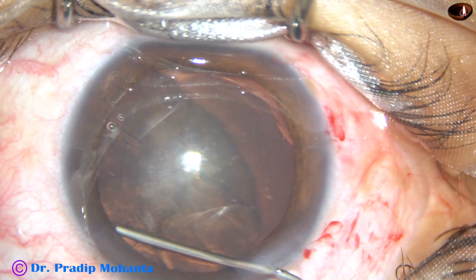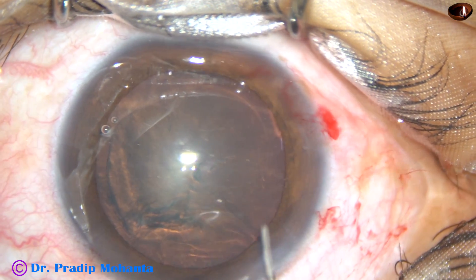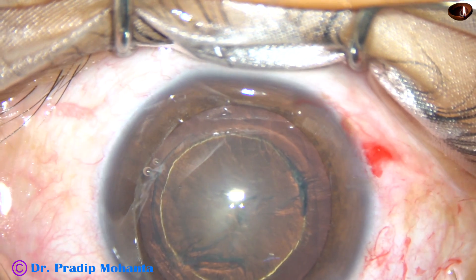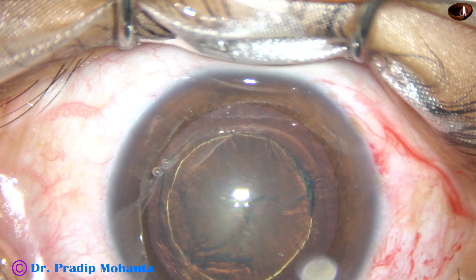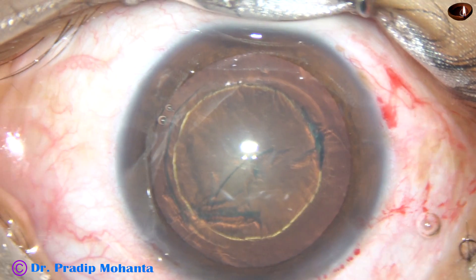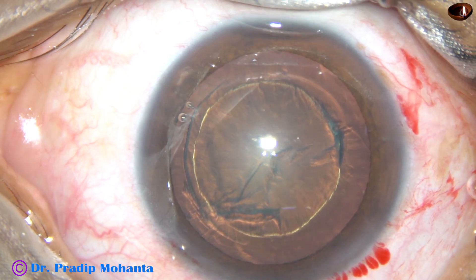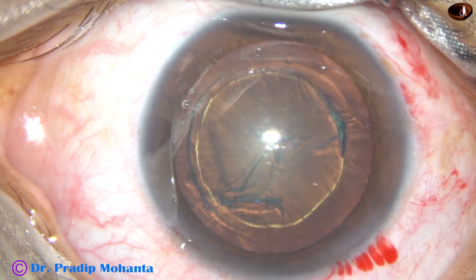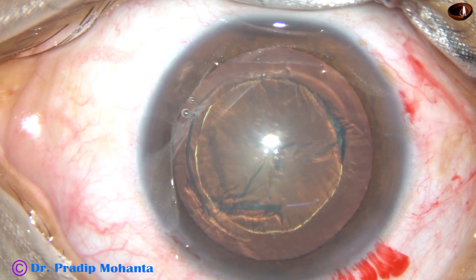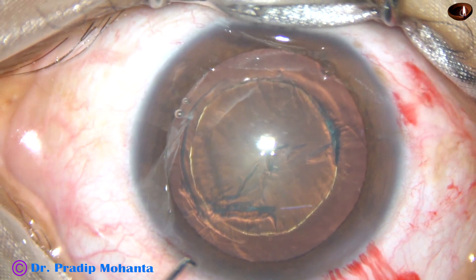The fluid wave is passed. As soon as the fluid wave goes to the opposite equator, stop in such cases — otherwise the whole thing will tend to come into the anterior chamber. Do hydrodelineation, and in this case hydrodelineation has produced a golden ring. The advantage is you will just remove the central portion in one go; aspirate it and the epinuclear shell will remain to protect the posterior capsule.